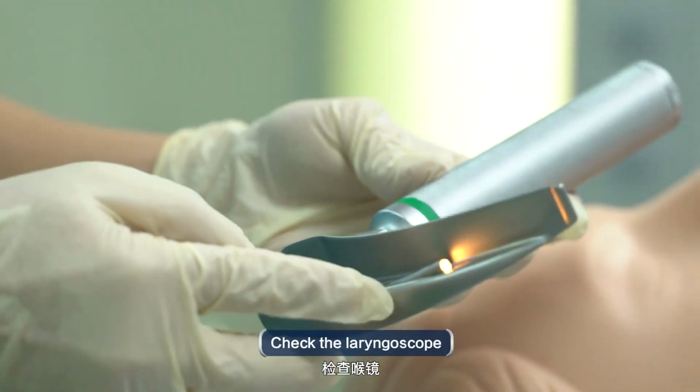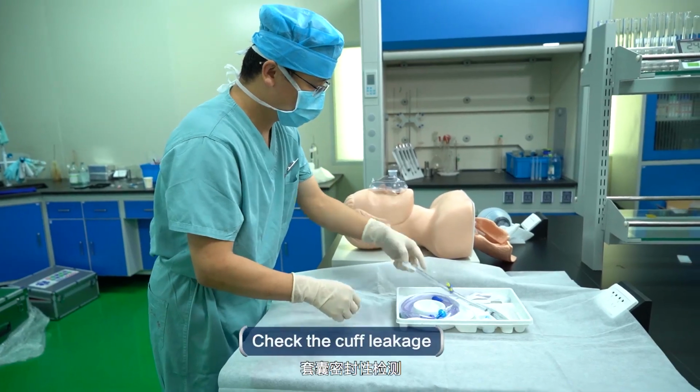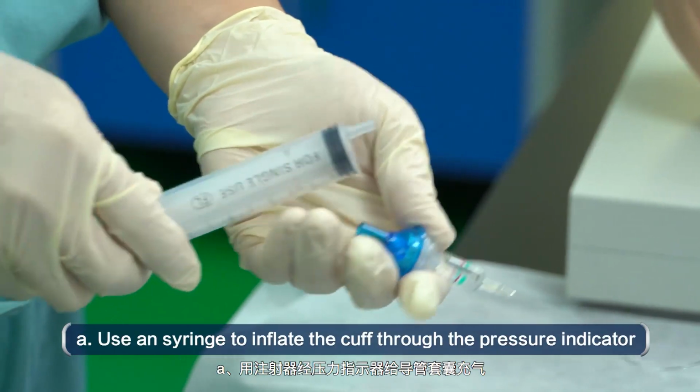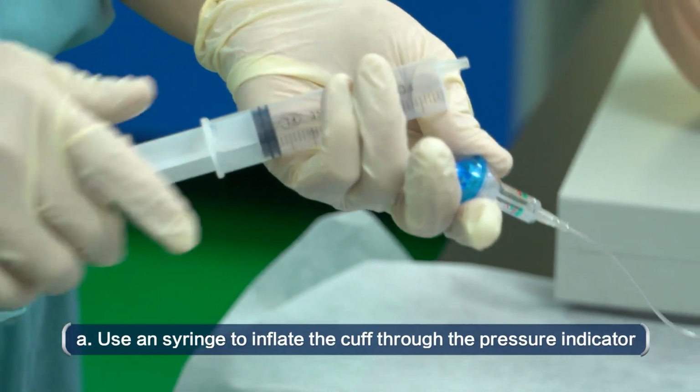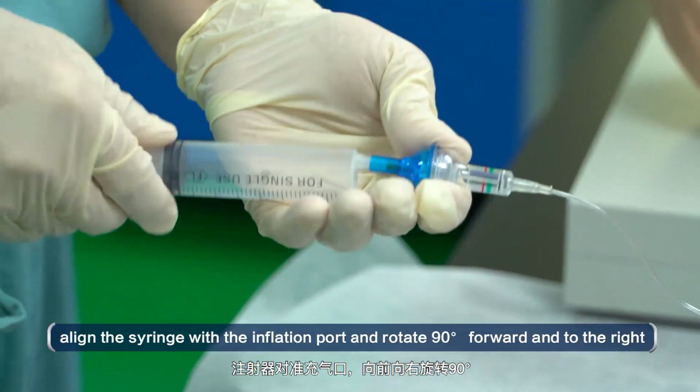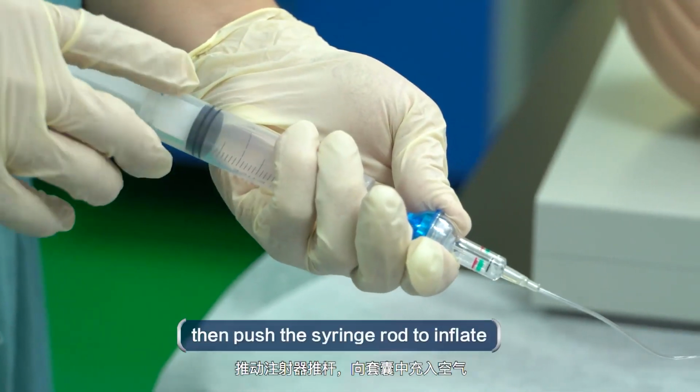Check the laryngoscope. Check the cuff leakage. A. Use a syringe to inflate the cuff through the pressure indicator. Align the syringe with the inflation port and rotate 90 degrees forward and to the right, then push the syringe rod to inflate.